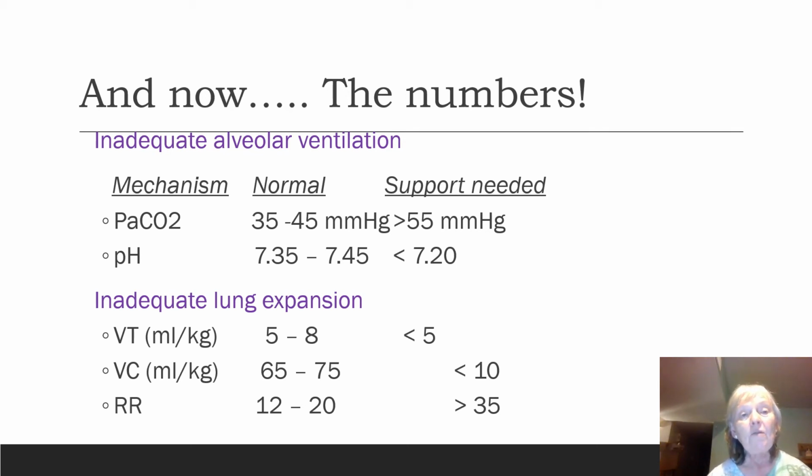If his tidal volume that you measured is only 300 mLs, 300 is less than 323, he then is a candidate for support. Okay? If you measure his tidal volume and it comes only to 300 mLs, his range starts at 323 mLs.